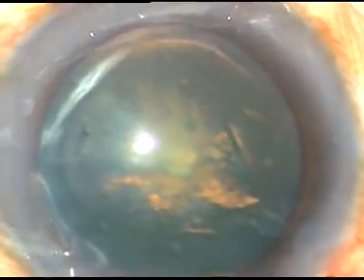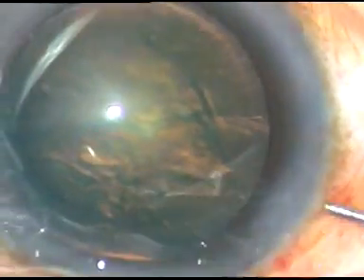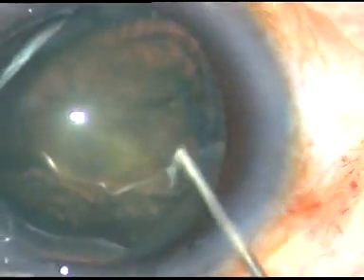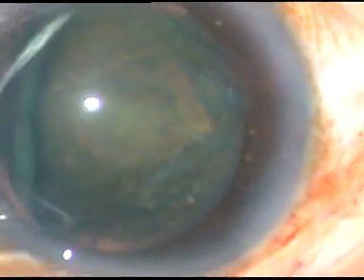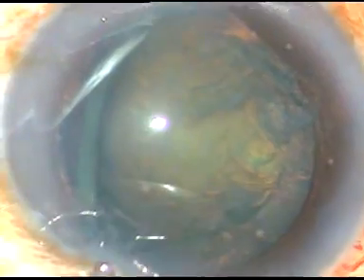Now hydrodissection is to be done. See how I tilt the lens. The lens is depressed, then hydrodissection is repeated and the lens floats. Never try to tilt the nucleus in the first attempt.